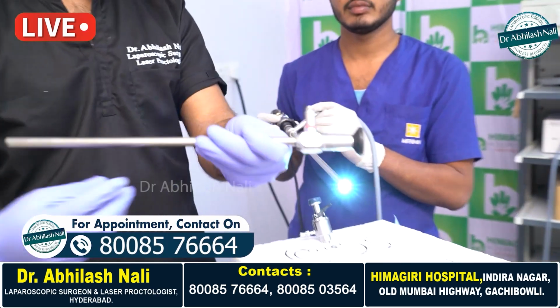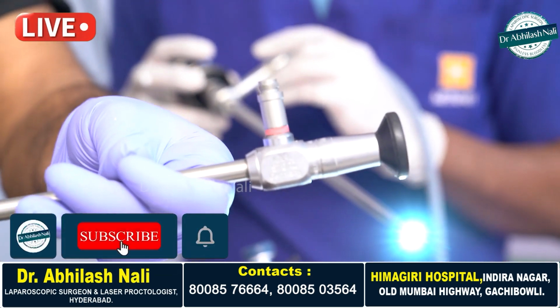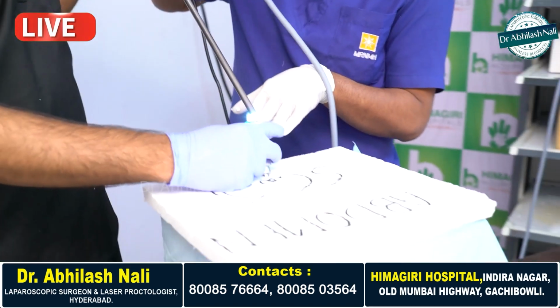You can see this is one of the reputed companies, an internationally renowned camera, because the camera quality actually decides the outcomes of the surgery. The better the camera clarity, the better will be the surgery and the comfort for the surgeon.